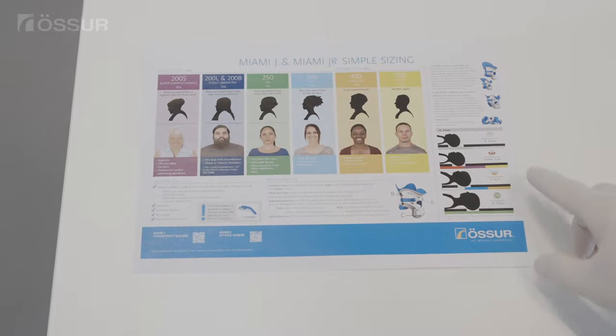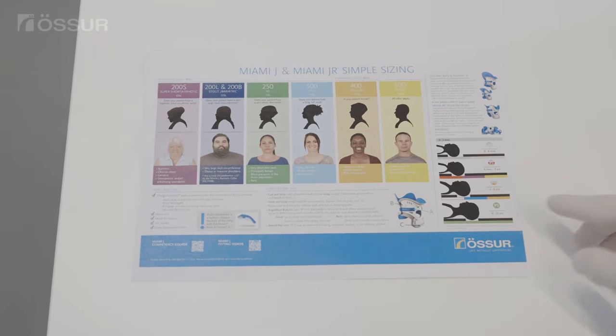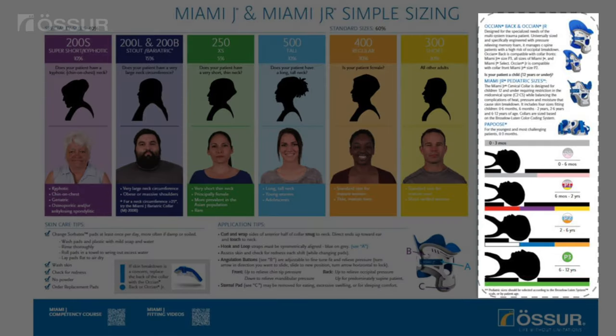To determine the appropriate collar size, select the Miami Junior collar size based upon the Braslau Luton color code or age using the label on the packaging or wall chart. We recommend patients 13 and older to use the Miami J.